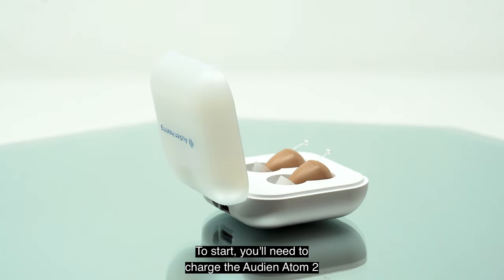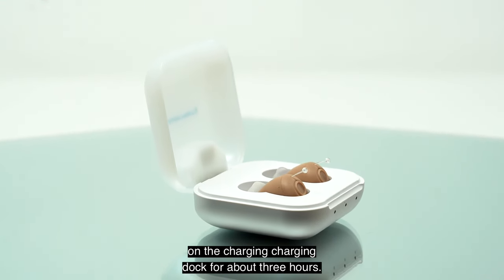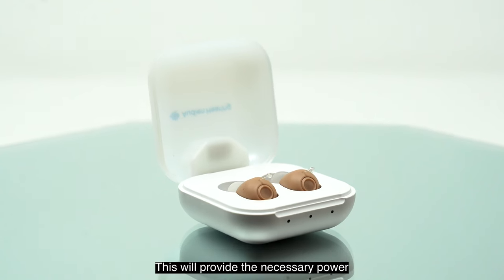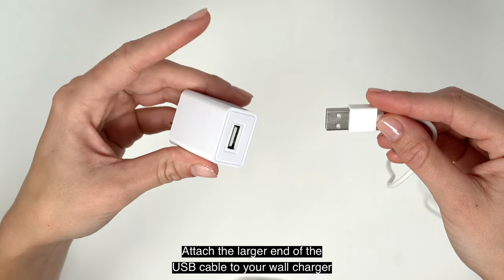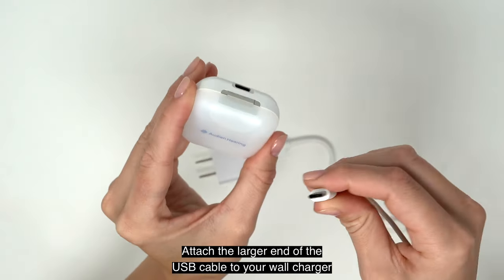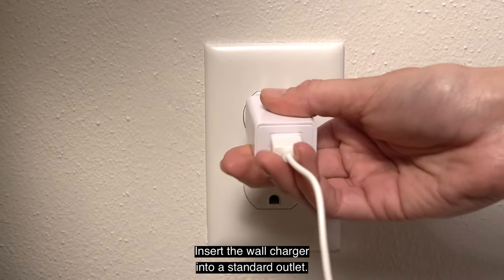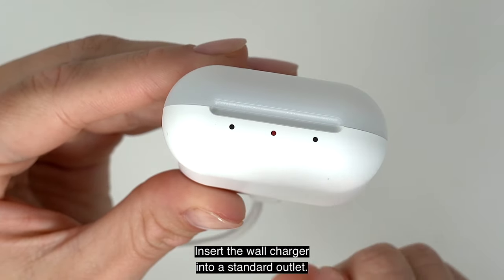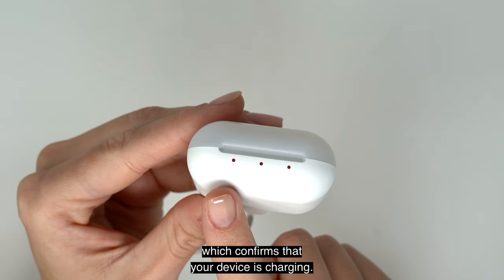To start, you'll need to charge the Audien Atom 2 on the charging dock for about 3 hours. This will provide the necessary power to keep your device operational. Attach the larger end of the USB cable to your wall charger and the USB-C side to the charging dock. Insert the wall charger into a standard outlet — the center red light turns on, which confirms that your device is charging.